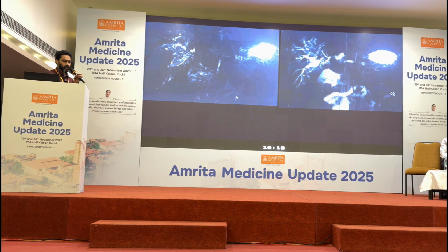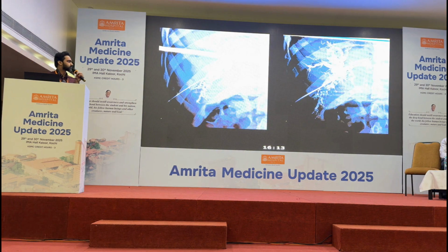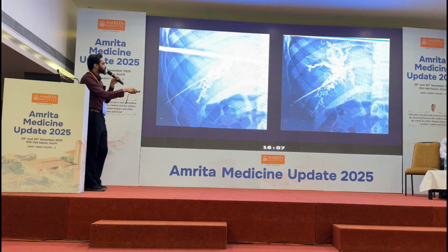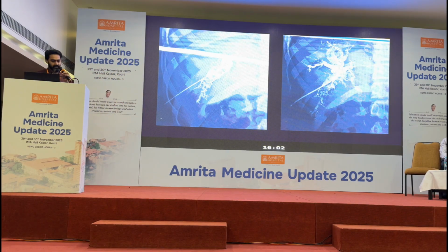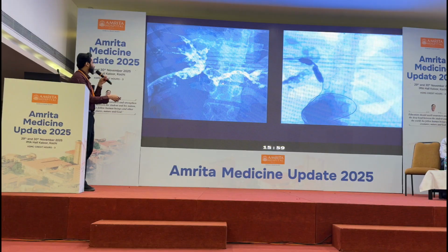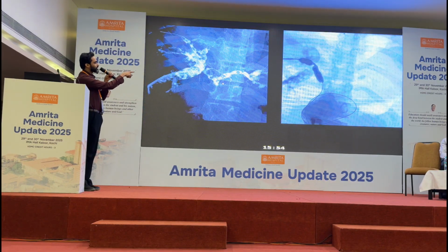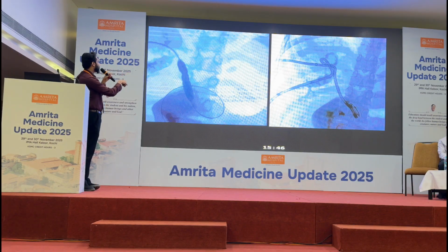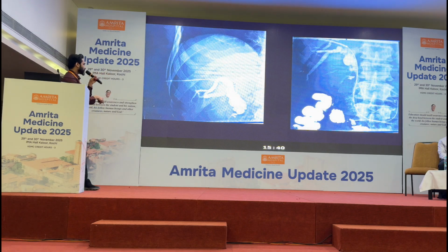So because she was having recurrent cholangitis, we proceeded with cholangiogram to drain this. But then when we did the cholangiogram, we can also see multiple strictures. So this is the stricture around the common hepatic duct. So we got in and then we put in a pigtail catheter, and after doing so, we decided to plasty that stricture. You can see that there is a balloon there at the point of stricture, and you can see a waist in the balloon, that is the point of stricture, and then we finally dilated and drained her with an internal external biliary drainage catheter, and a pigtail catheter.